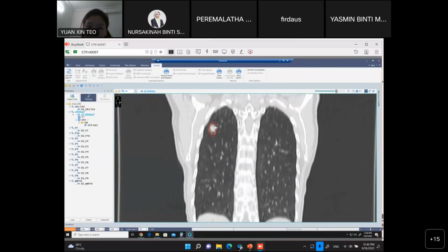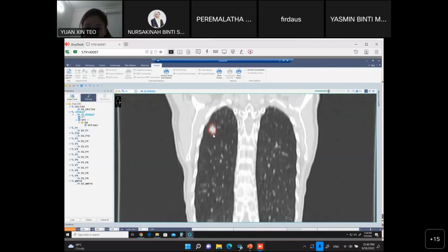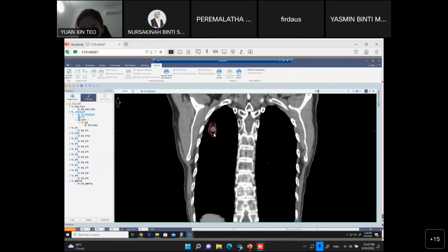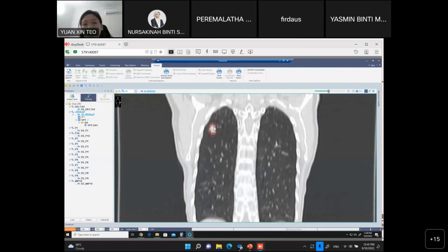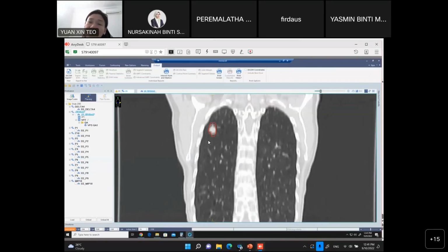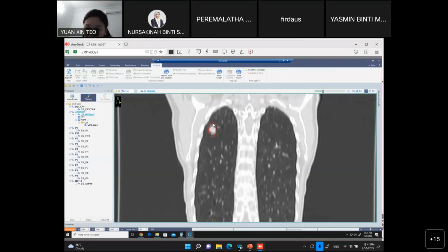The brown color is the GTV. The doctor contours according to the motion of the tumor. Then only she adds another 2 mm PTV margin to account for planning reproducibility discrepancy. This is what the doctor does for these patients.